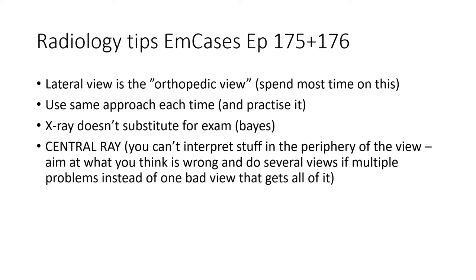So just some take homes here from EM Cases: the lateral view is also the orthopedic view, so spend most time on that one. Use the same approach each time. Use systematics. Then you'll become better and better at it and know when there are differences. When you've seen a lot of normal, then you know when there's abnormal. X-ray doesn't substitute for exam. Use Bayesian principles for that and gather a good pretest probability.